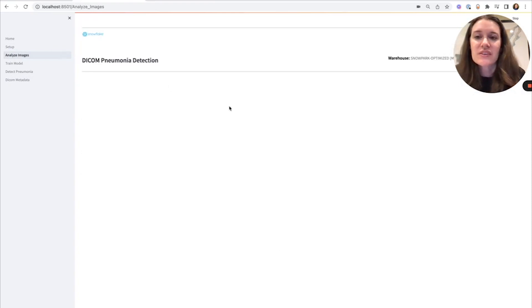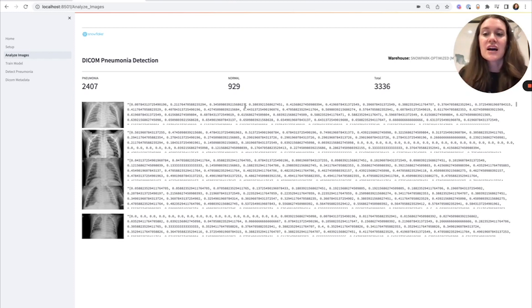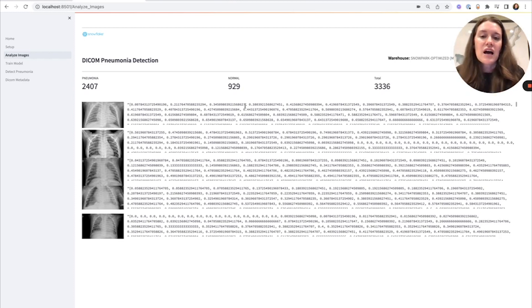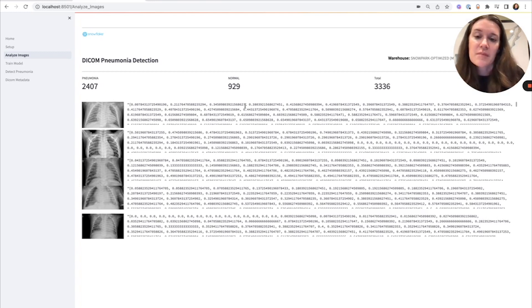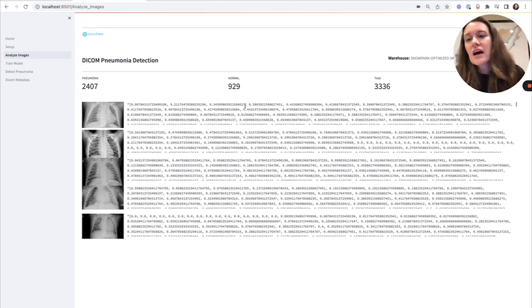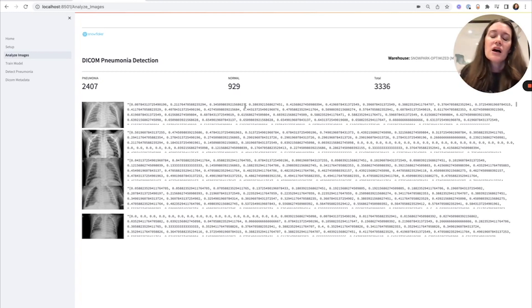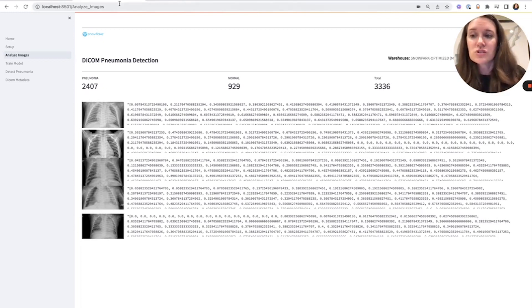What happens when we actually get these images in? The first thing we want to do is vectorize those images — do some pre-processing and get everything into a standardized size; here I'm using 150 by 150. We convert the image into an array using the SK image library. In my dataset, I have about 3,000 total images. About 2,000 of those have been pre-classified as having pneumonia, and about 1,000 are classified as normal. This will be the data I use to train my model.